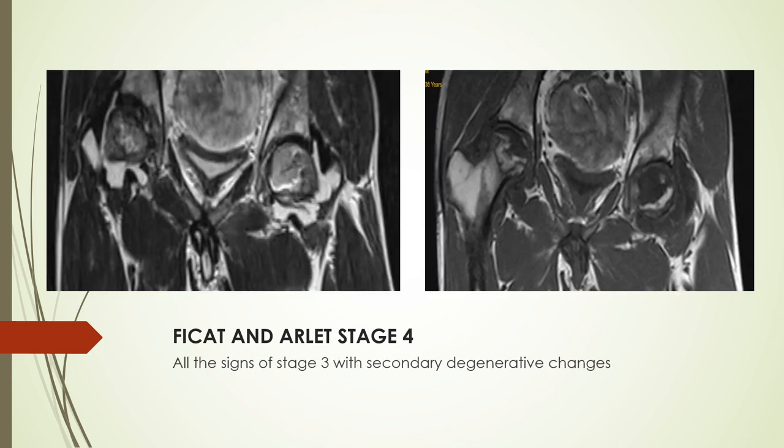In stage 4, all the signs of stage 3 are present along with secondary degenerative changes in the surrounding acetabulum and femur, as seen in these T1 and T2 coronal images.